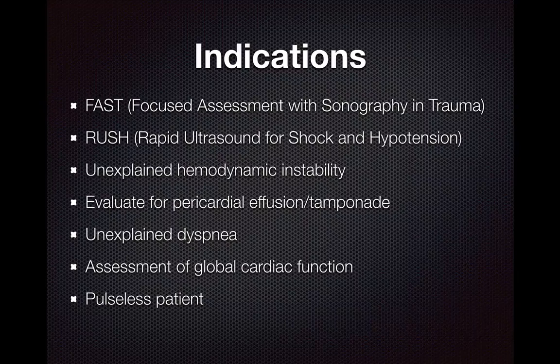Similarly, we'll use this in the RUSH exam in the shocky patient or hypotensive patient, and it has a similar role there. Really, any patient with unexplained hemodynamic instability, meaning low blood pressure, high heart rate, this is a good scan to do. It can be used to evaluate for pericardial effusion, so any fluid around the heart, and cardiac tamponade, when that fluid is actually compromising cardiac function.